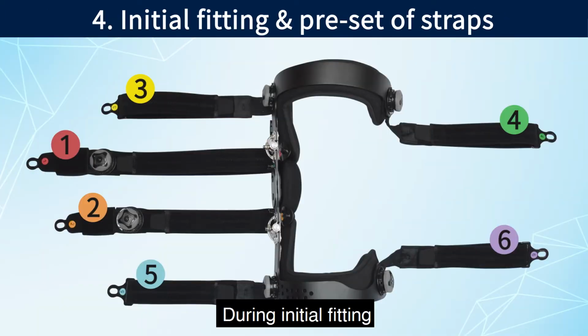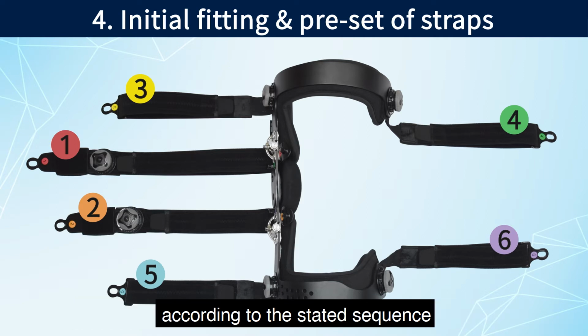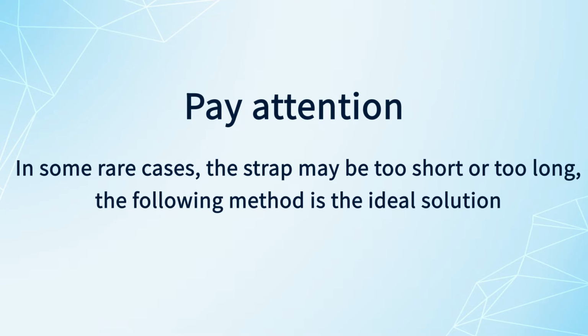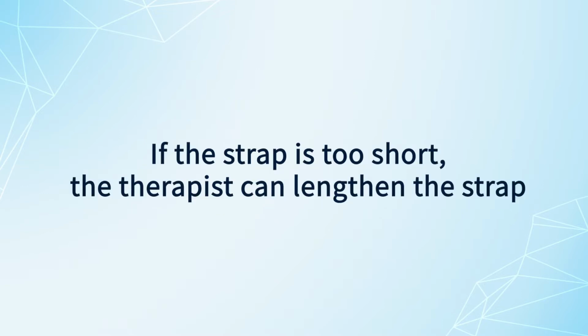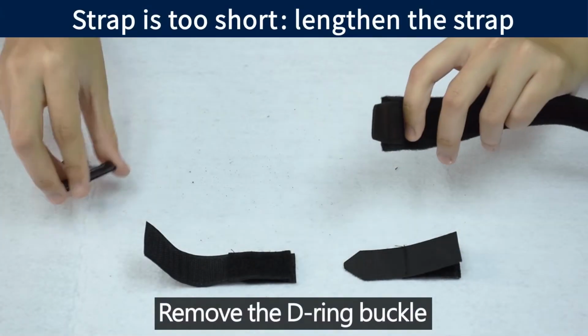4. During initial fitting, the therapist needs to preset the length of each strap according to the stated sequence. Pay attention, in some rare cases, the strap may be too short or too long. The following method is the ideal solution. If the strap is too short, the therapist can lengthen the strap. First, remove the D-ring buckle.